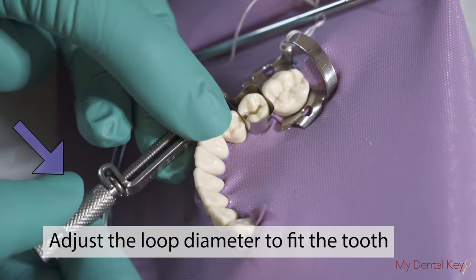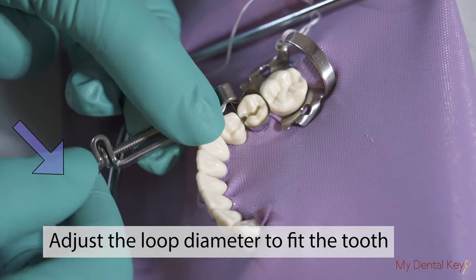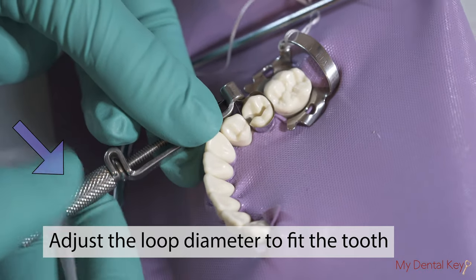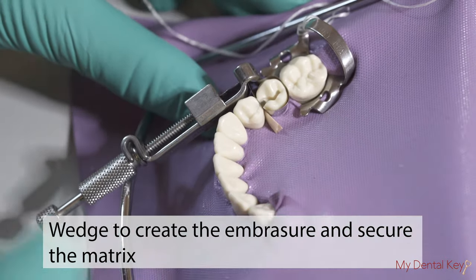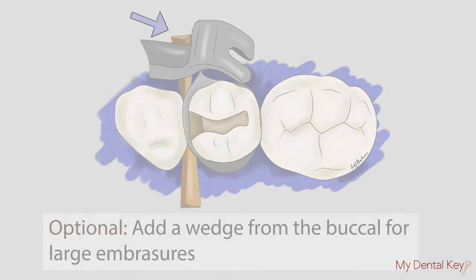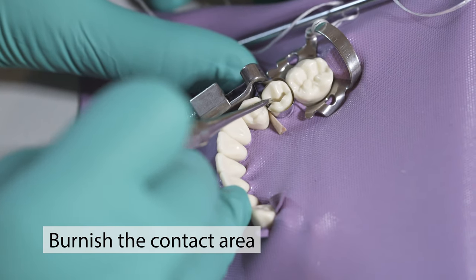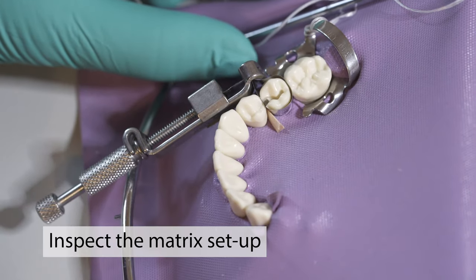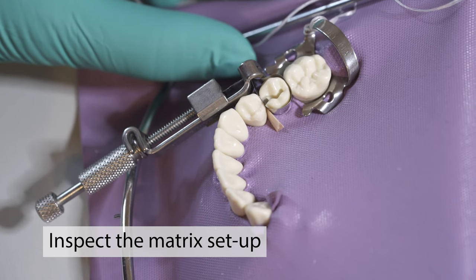Adjust the diameter of the matrix loop around the sides of the tooth by turning the adjusting nut in a clockwise direction. Place the wedge to create an embrasure and secure the matrix. Optionally, you may also add a wedge in from the buckle in addition to the lingual. For larger embrasures, burnish the contact area using a hand instrument. Then, inspect the matrix setup to ensure that all edges are sealed around the tooth.